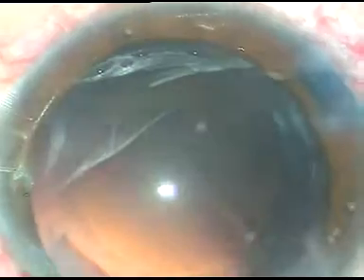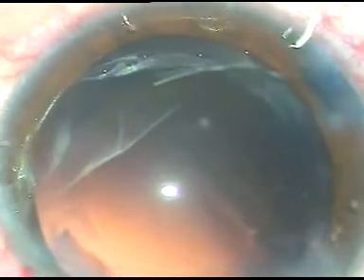The cortical matter from 12 o'clock, 11 o'clock, 1 o'clock are removed. In this case, there are no cells sticking to the posterior capsule and the posterior capsule is very clear.